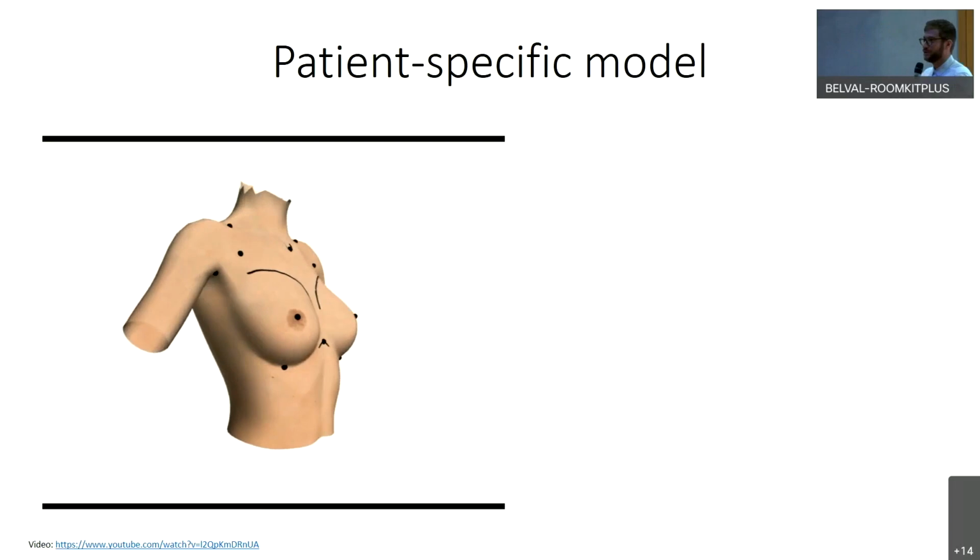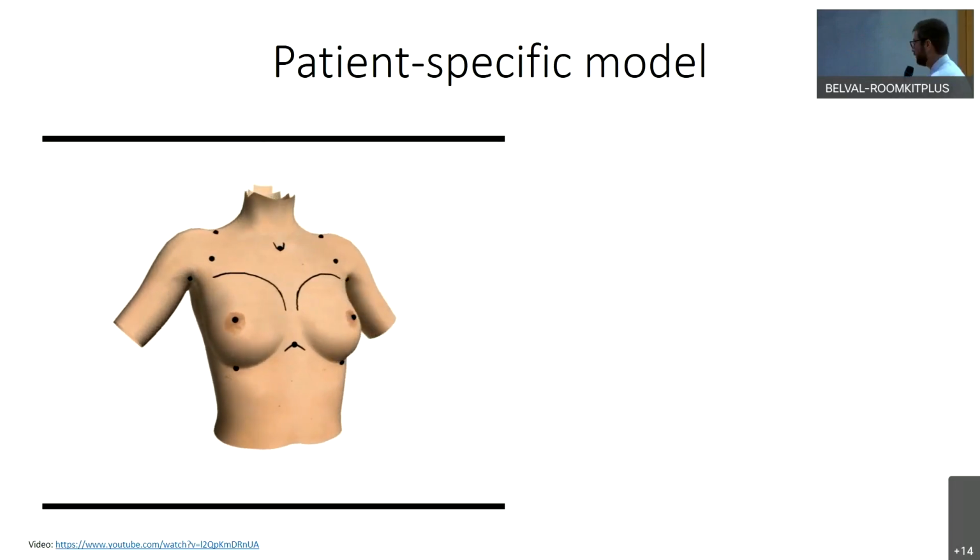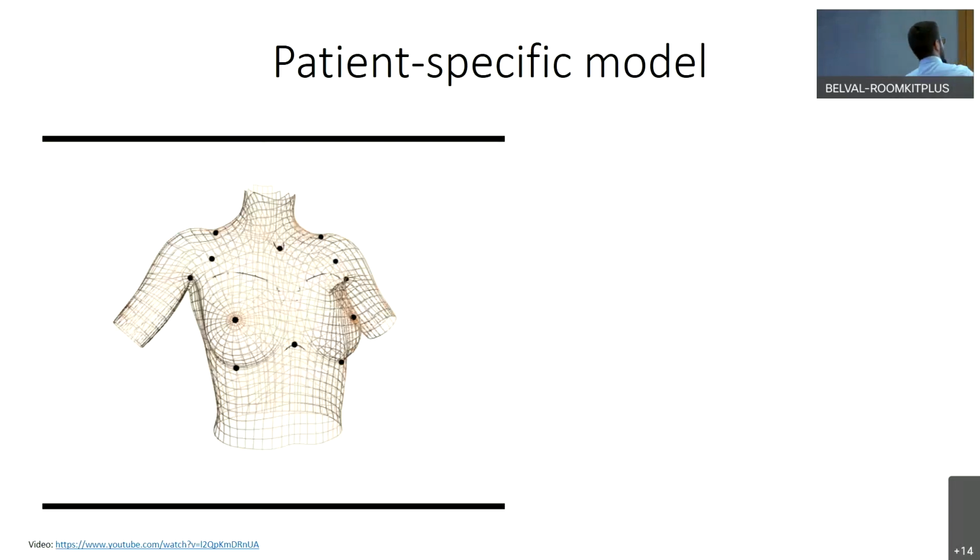Then we ask the surgeon to do the drawing on this model, that you can see with the curves. And we also added some anatomical landmarks that can be useful for the surgeon, such as the nipples or the sternum.